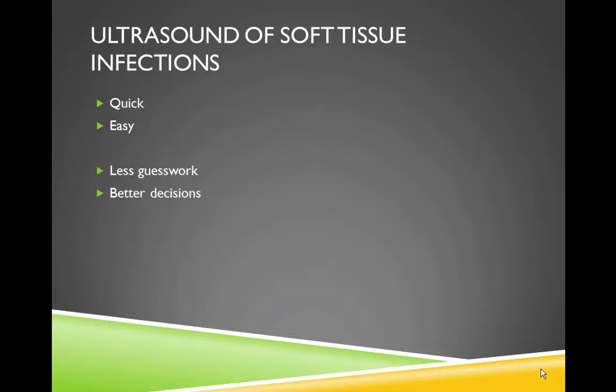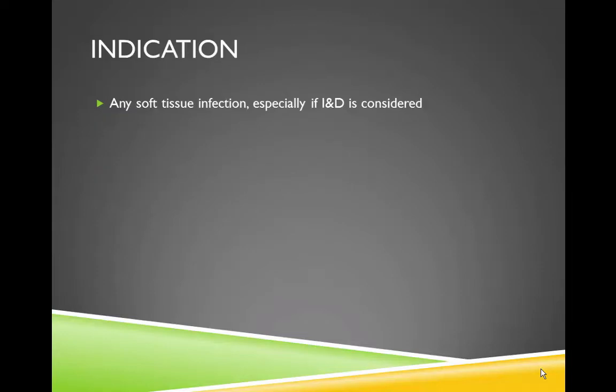This is low-hanging fruit as far as ultrasound goes. This is quick, it's super easy, and when you do this, you can do a lot less guesswork and make better decisions. Even though this probably doesn't save a lot of lives and it's not a super sexy topic, this is a place where you can really make a big difference in what you do for patients, change your decisions, and make patient care better.